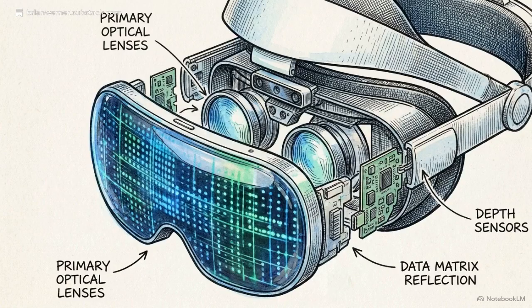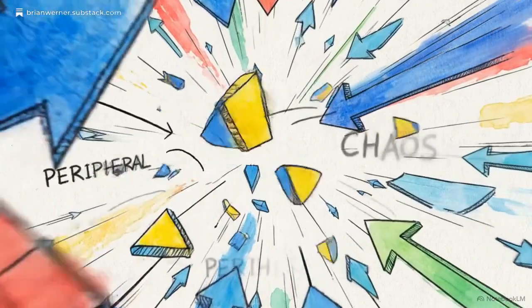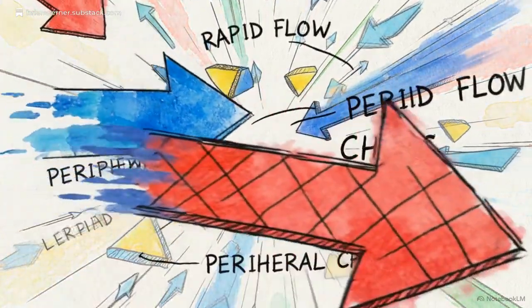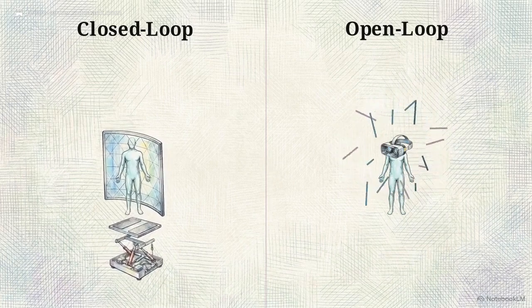Modern virtual reality provides the technology to surpass Nashner's closed-loop model. VR goggles or immersive screens allow us to introduce true optokinetic flow, a continuous, randomized visual stimulus that moves independently of the patient. Here is the mechanical difference. On the left, the closed-loop environment moves only when the patient moves. On the right, the open-loop VR system moves independently.